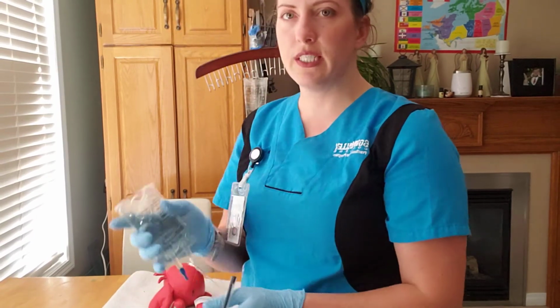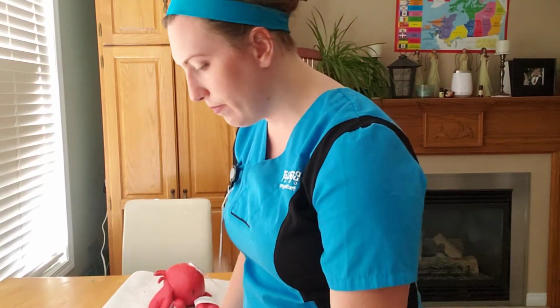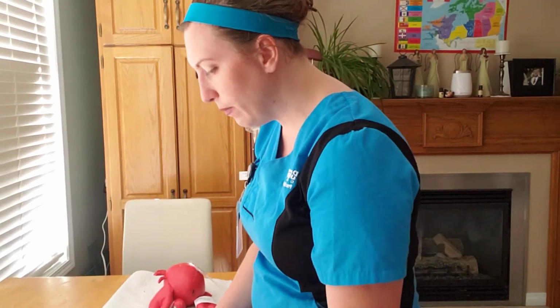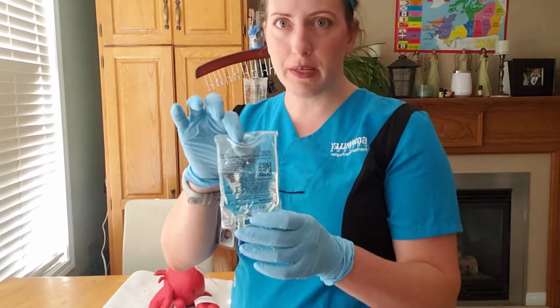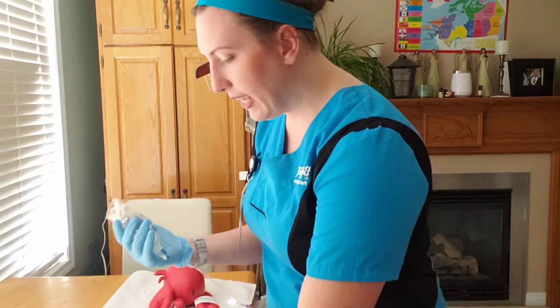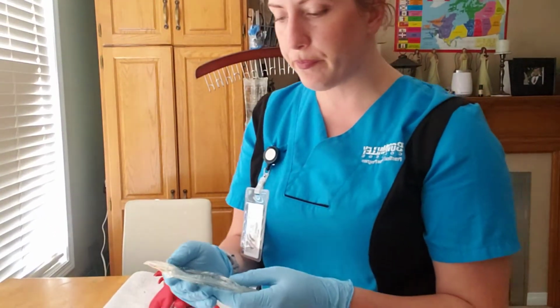Next thing I'm gonna do is pull out my infusion bag, which I'm gonna dilute my medication into. So it says on the monograph, we need a bag that contains between 25 mils and 100 mils. The bag I selected today has 50 mils, so we've got the right volume. Again, I'm gonna put that as part of my total volume of fluid. So we've got 52 mils of total volume.